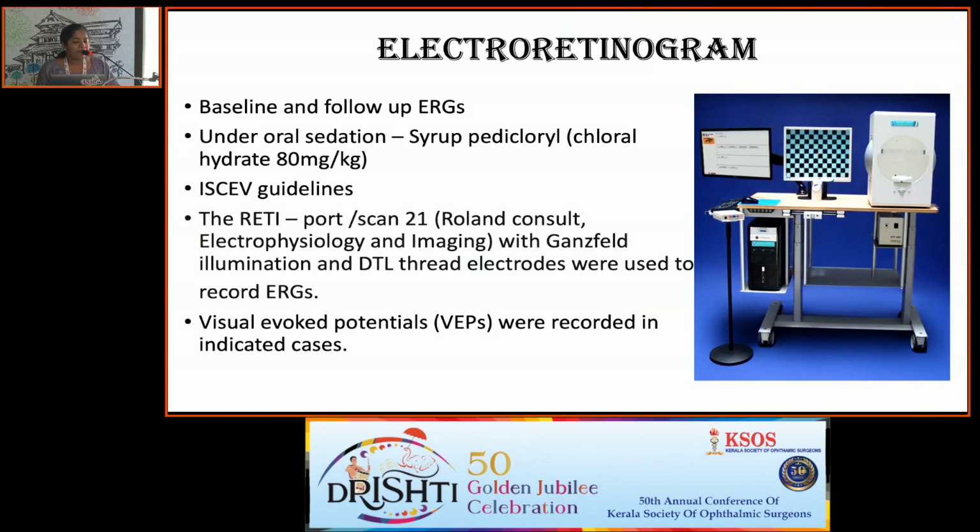So baseline and follow-up ERGs for these patients were done under oral sedation with chloral hydrate syrup, a weight-dependent dosage according to the pediatric prescription and according to the ISCEV guidelines, in RETIscan with Ganzfeld illumination and DTL thread electrodes. Visual evoked potentials were also recorded only in the indicated cases.